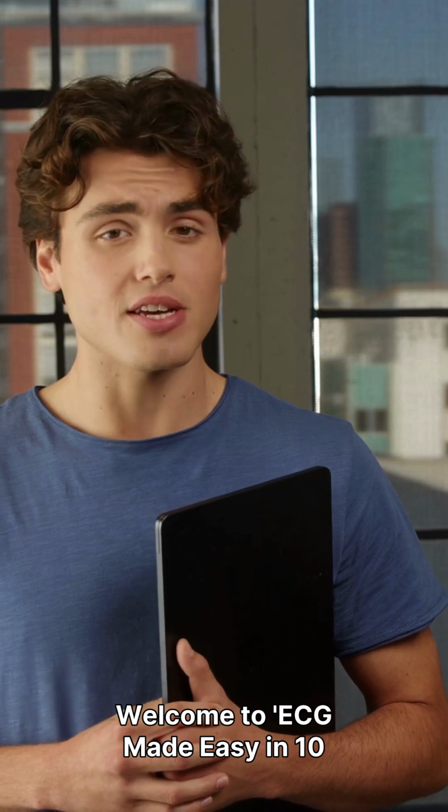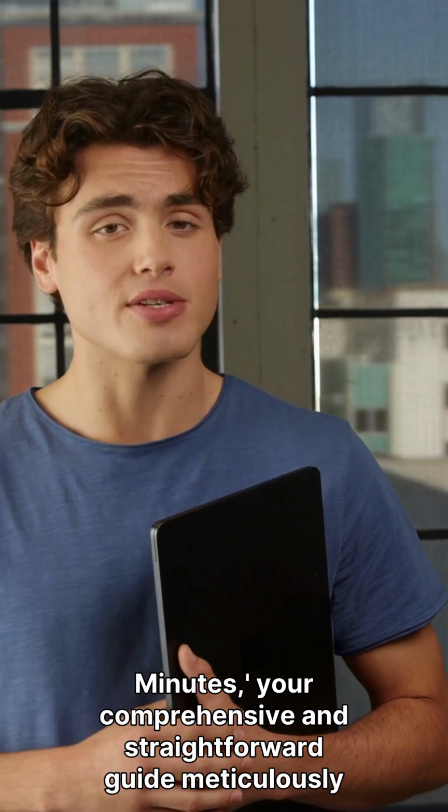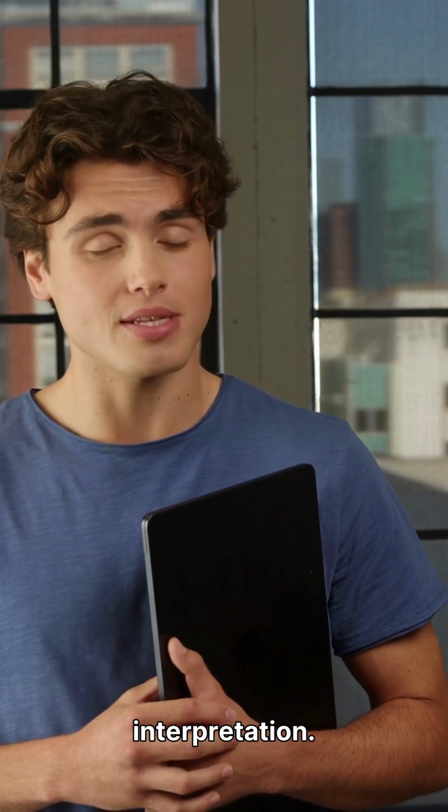Welcome to ECG Made Easy in 10 minutes, your comprehensive and straightforward guide meticulously designed specifically for MBBS students, medical interns, and candidates preparing for crucial exams, helping you build a solid foundation in ECG interpretation.